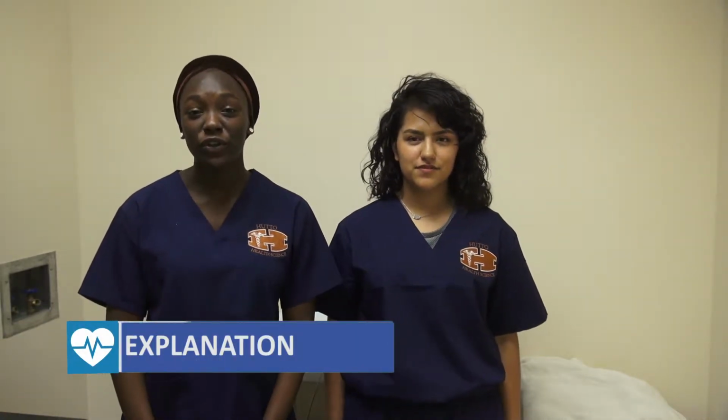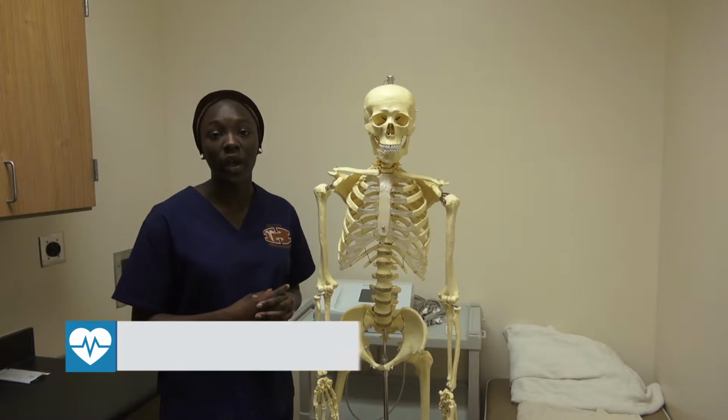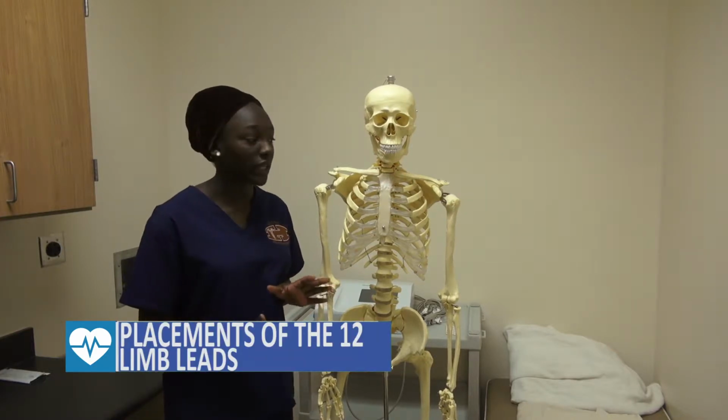Today we're going to be showing you guys how to perform an EKG. An EKG is also known as an electrocardiogram. In today's case, we're going to be doing a 12-lead EKG, which will record 12 different views of the conductivity of the heart. Okay, so right now I'm going to show you the different placements for the 12-lead EKG on this skeleton.